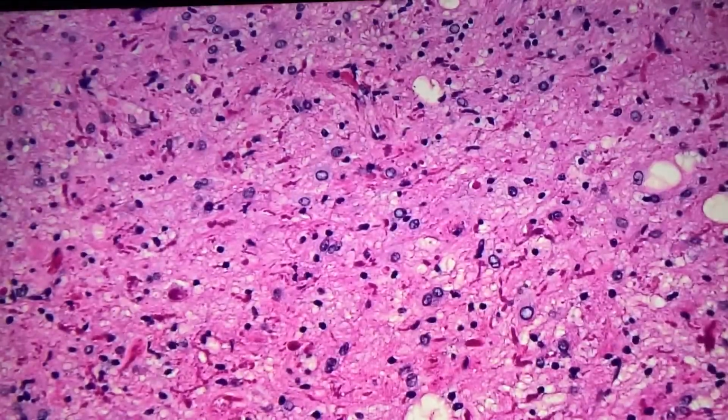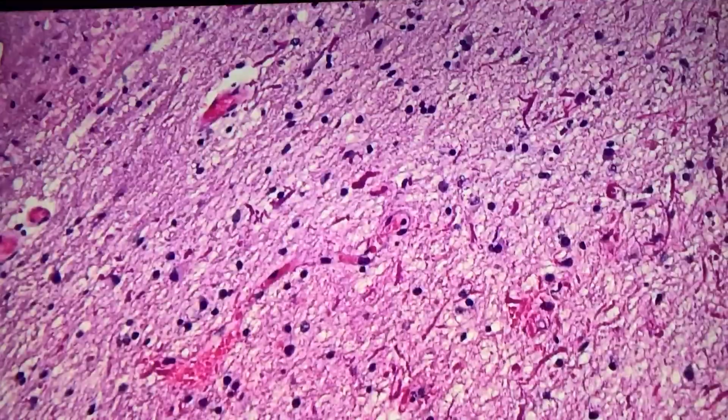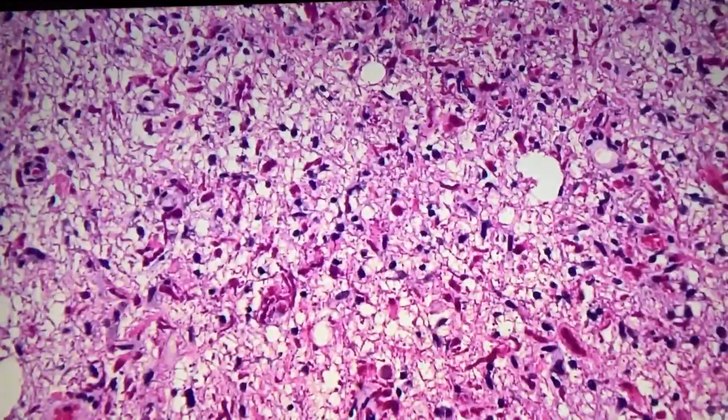Okay. So final diagnosis in this case? It's a ganglioglioma. You can see this perivascular chronic inflammatory infiltrate in that tumor. My bad for not finding the ganglion cells. I should have marked them, sorry. But let's assume that there are ganglion cells here. Questions, Dan? Does that make sense? Yeah. Everybody else, does that make sense?